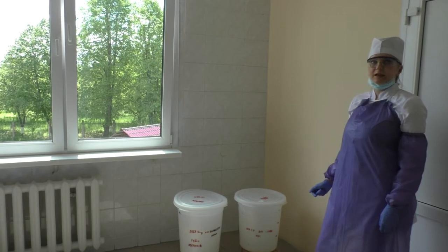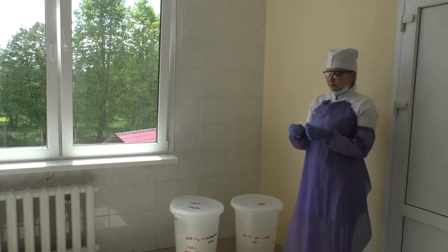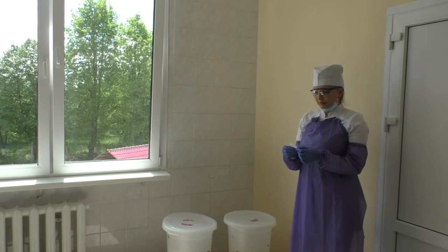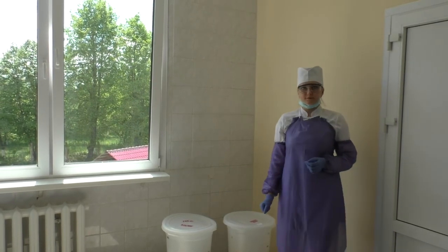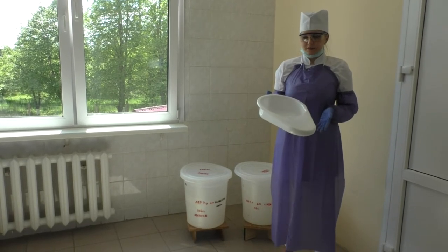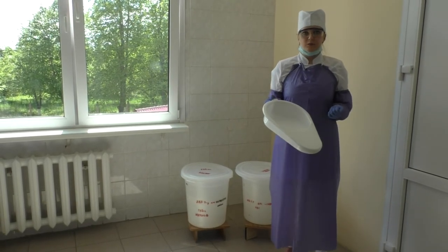You should check the concentration of the disinfectant solution and the time of exposition. You should also prepare the bedpan or urinals for disinfection.